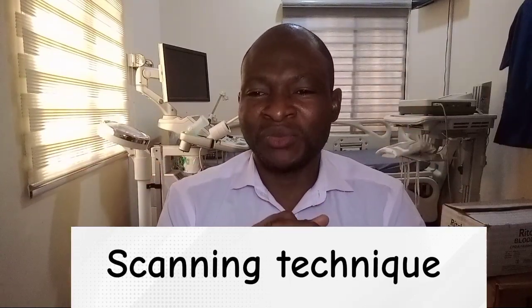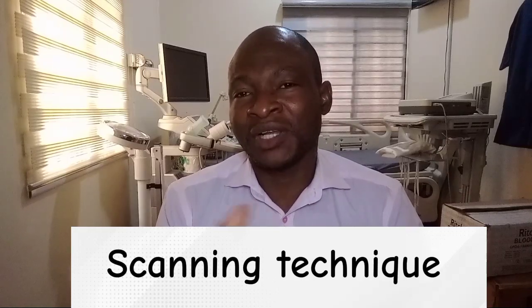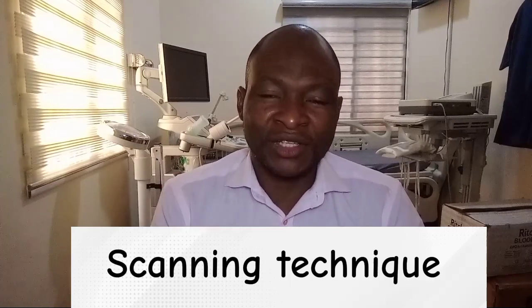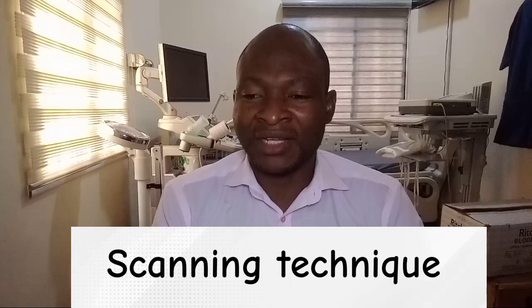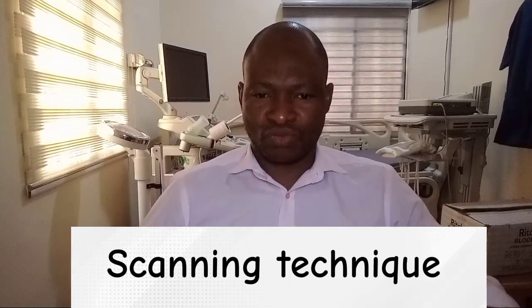Often you will have a problem with bowel gas overlying the pancreas, of course, and also gas from the stomach. So how do you overcome these challenges? You overcome it by inspiration, by expiration. You distend the abdomen against the probe, ask the patient to push their stomach out.